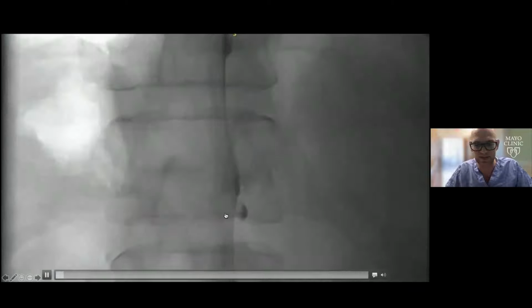I know people have probably shown these things, but here's a nice picture of a CSF venous fistula in action on a digital subtraction myelogram. You can see here how that contrast is going out of the nerve root sleeve, into the foraminal vein and then into the azygous venous system. That's a nice unsubtracted view, and here's a nice one on the subtracted view as well.